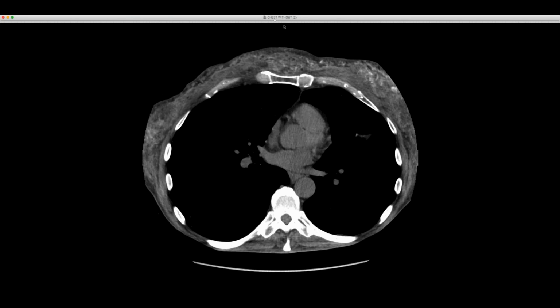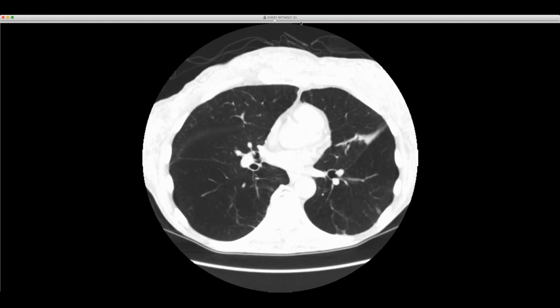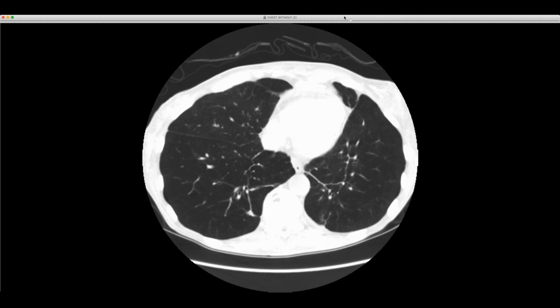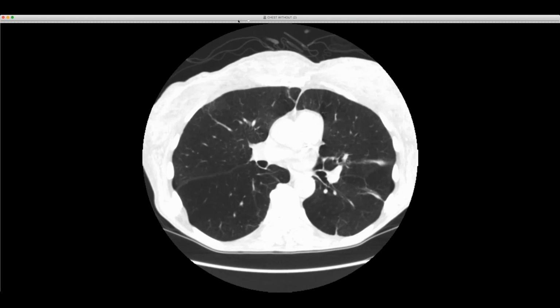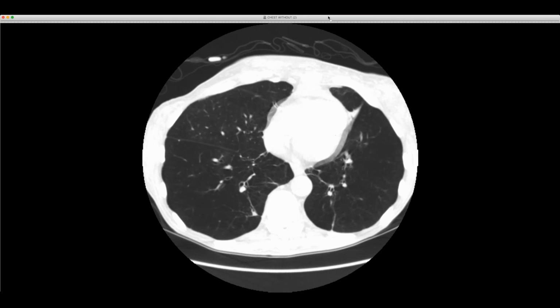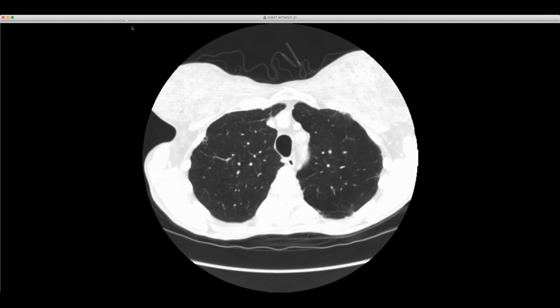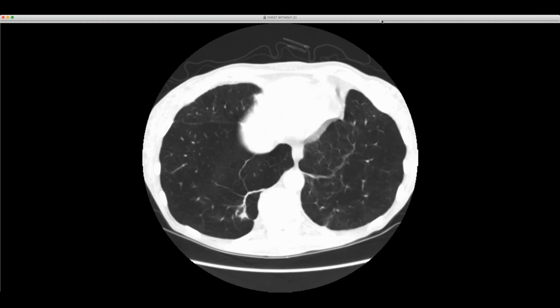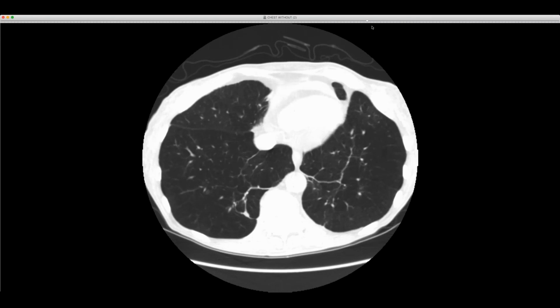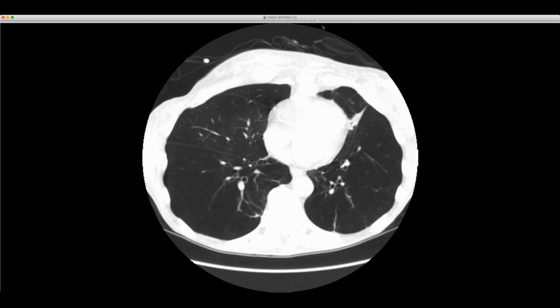Yeah. What do his lungs look like? So one thing is he has some severe emphysema. I don't know if this is a particle-related emphysema or if he has some sort of... He is a smoker, but it certainly has a lower lobe predominance. So is he alpha-1 antitrypsin deficient as well? It's hard to say. He doesn't really have a pneumonitis due to silicone injections, but he does have an interesting lower lobe finding. That could be injected tablets again around here. Yep. All right.